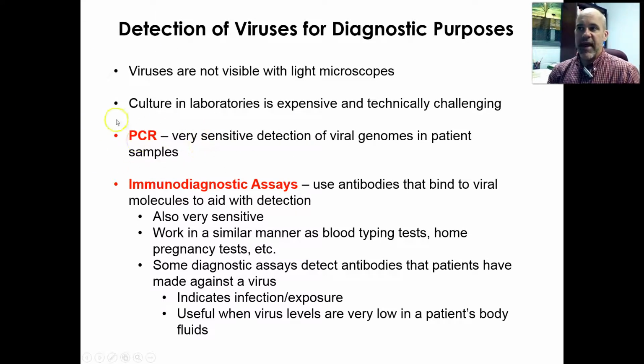All right, so are those types of techniques being routinely done in clinical laboratory settings? Not yet, but probably not too far down the road. We will see that happening. There are companies, though, that make their livelihood by developing and carrying out very sophisticated PCR assays that can detect viruses and other types of pathogens as well.